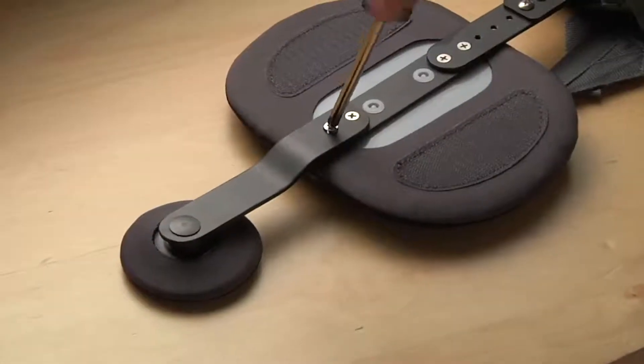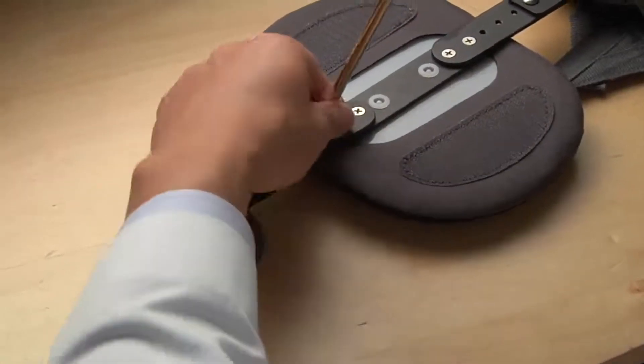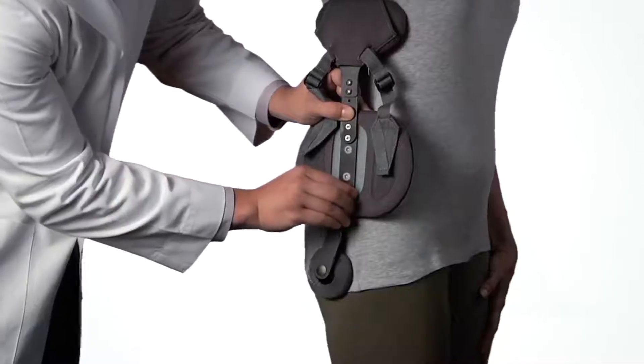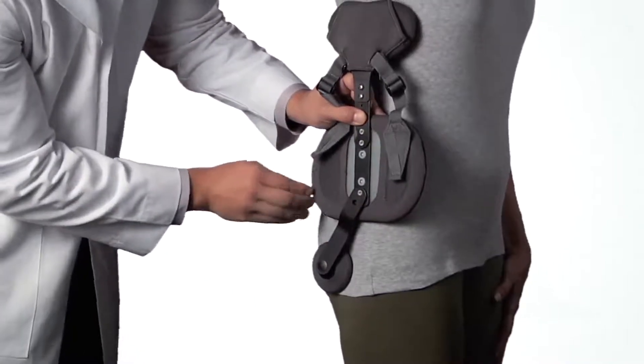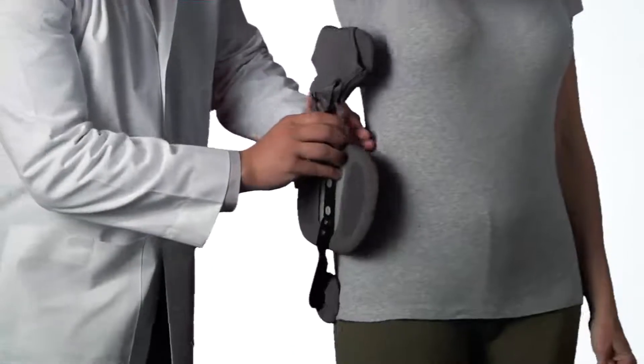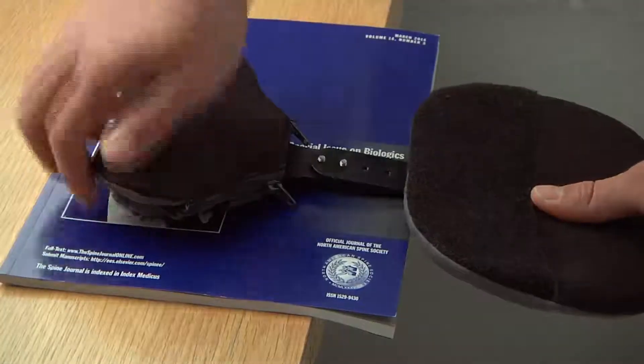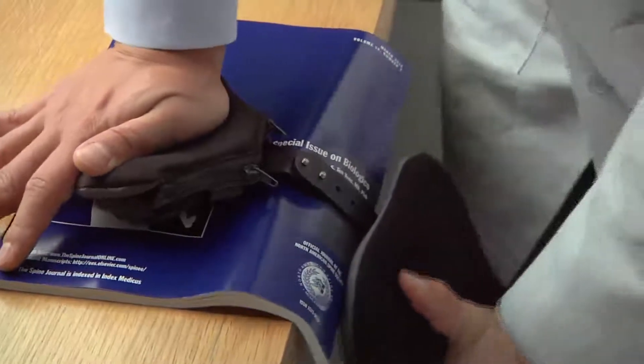To adjust the trochanter pad position, remove the lock screw, angle the trochanter strut to achieve a proper fit, and replace the lock screw. The pads should fit flush against the body. For certain anatomies, it may be necessary to bend or twist the struts using the edge of an appropriate surface.